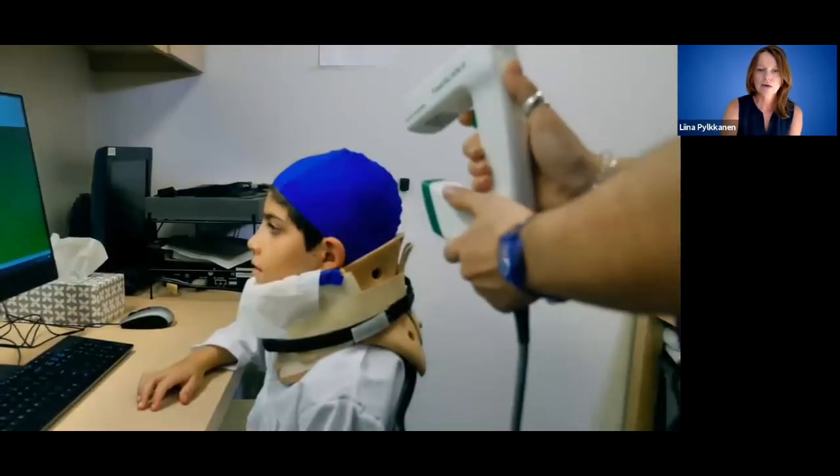And then the other thing that we need to do before we actually start the experiment is take a 3D scan of your head. The reason why we do that is because oftentimes we don't necessarily have access to an image of the person's brain. An important part of MEG data analysis is that we localize the neuronal currents that are generating the magnetic field. So we have algorithms that figure out exactly where in your brain the magnetic field was generated. And we ideally plot that activity and do that analysis in the space of your actual cortex, so we would have an image of your brain.